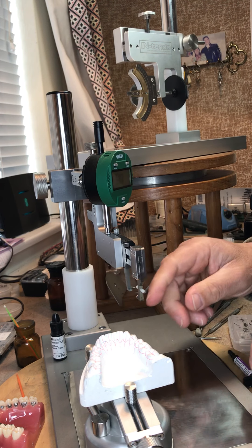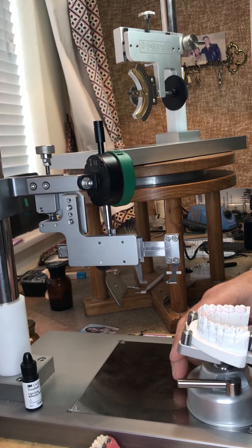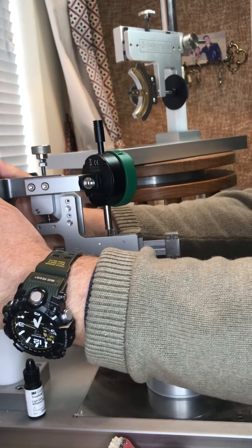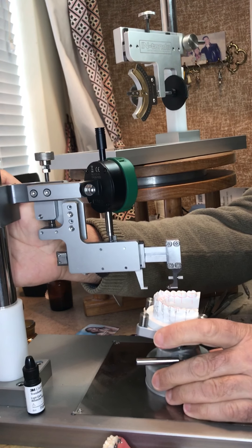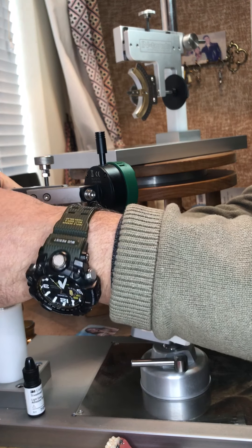I put one on here for the lower incisor — or lower anterior, because all the anteriors are the same — and then I bring it in, bring this down, and lock it.